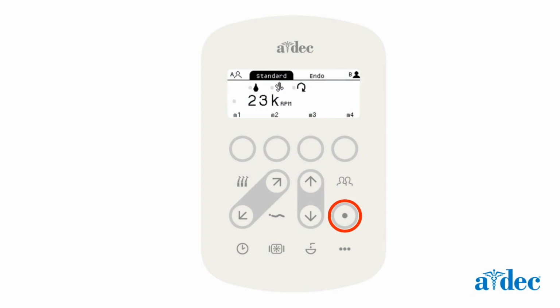When the Adjustment button is in use, a dot will appear to indicate which item is selected for adjustment. For dynamic handpiece modes, such as on an electric handpiece, keep pressing the Adjustment button to move the dot to the desired item. Use the chair base up or down arrows to adjust the chosen item.